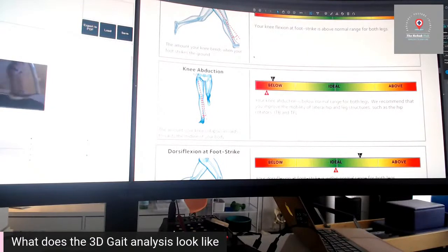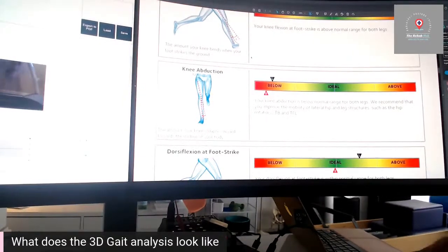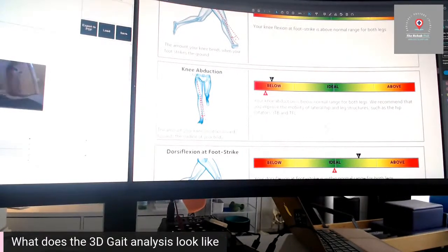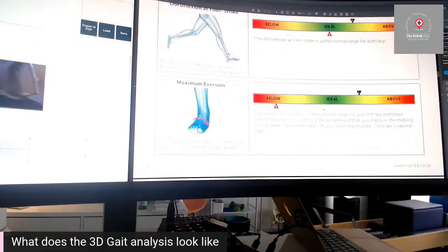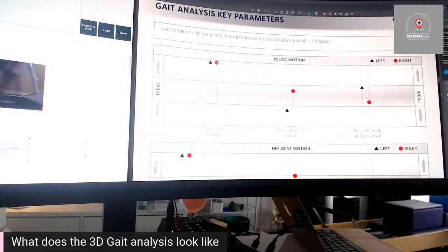Other patients have maybe been referred over from their physio or other healthcare provider, and we then essentially do the movement analysis and hand them back with this report to their healthcare professionals. So we do a lot of that, or they get the rehab with us. So there's a good mix there. It gives them this traffic light system of where they sit within the mean, and it starts to build up a picture of why they're getting maybe an overuse injury or a particular pain output.